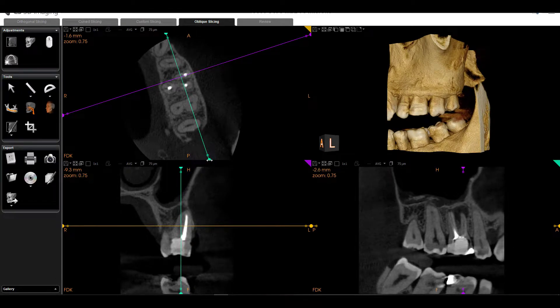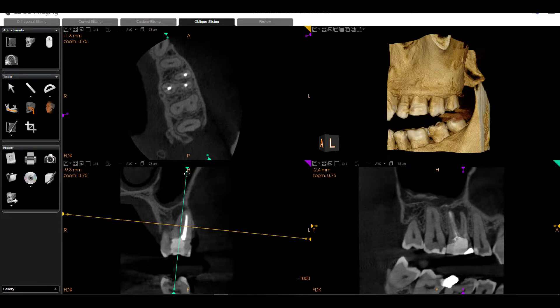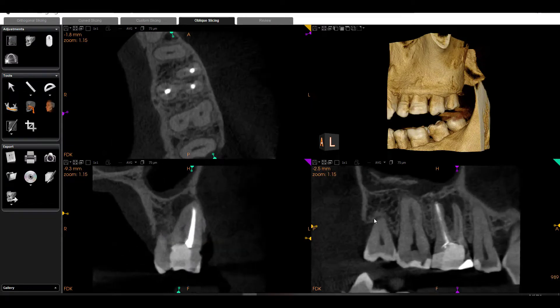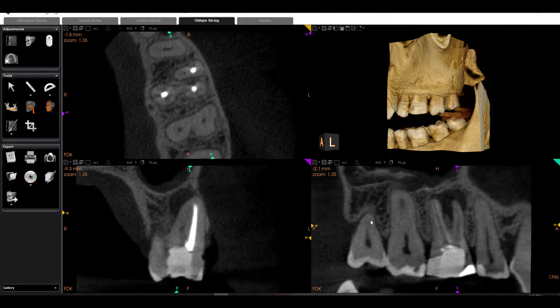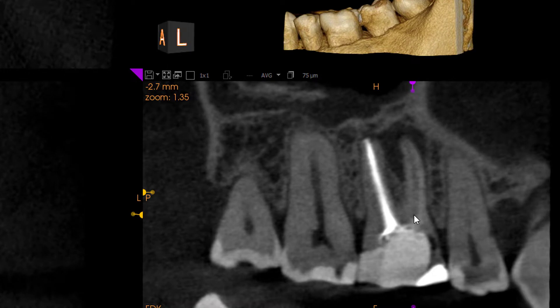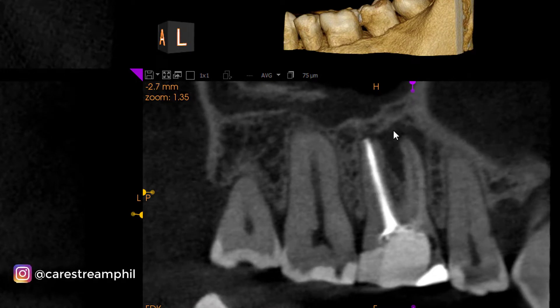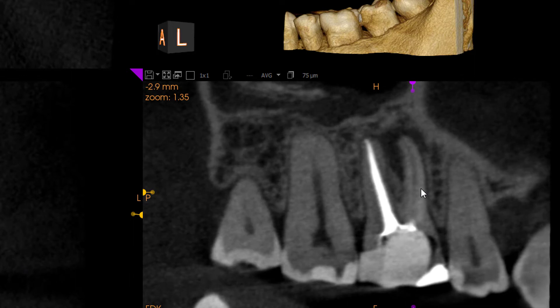Let's go back to our MB2 and go ahead and change some of the angulation to the long axis. Let's zoom in. Now I can actually slice back and forth and have a real nice visual of our missed MB2 canal. I can see the associated low-density lesion, which is the epicenter of that missed canal. I can see the portal of exit for that missed MB2 canal — just a real nice visualization of a simple MB2 case. I hope this helps.